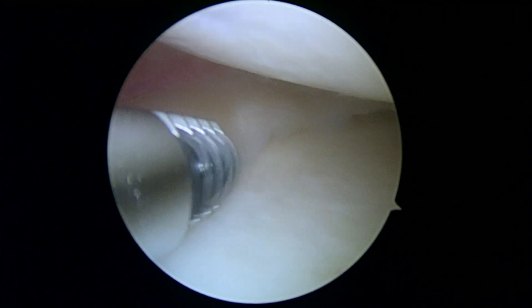It's Dr. Buford. We're just getting started on the left knee. We're looking in the medial compartment first. We know there's a meniscus tear here.